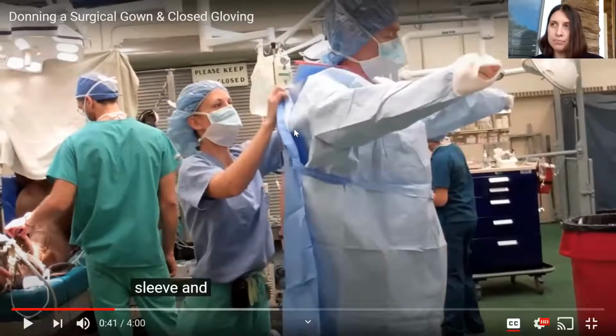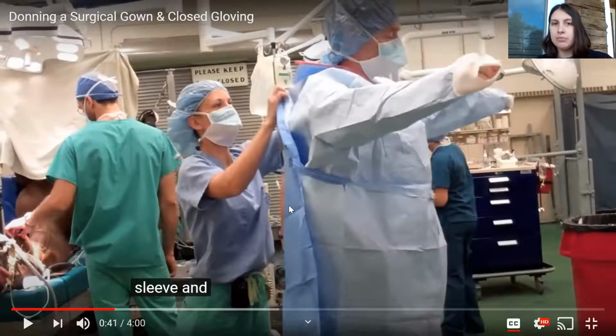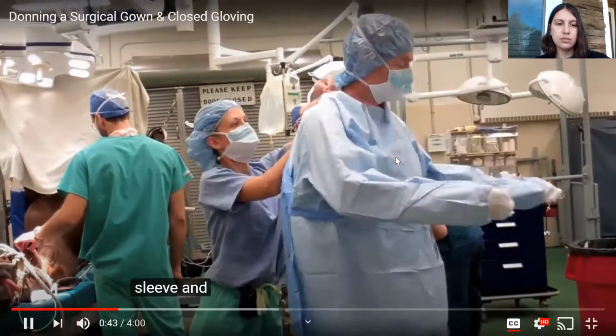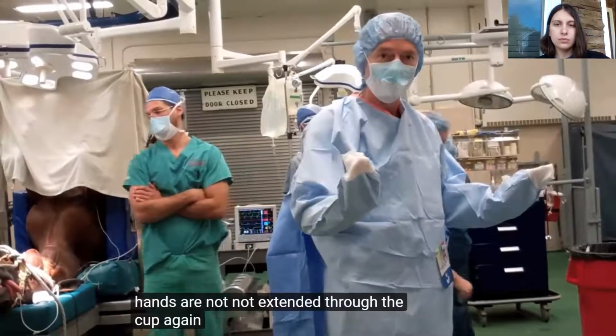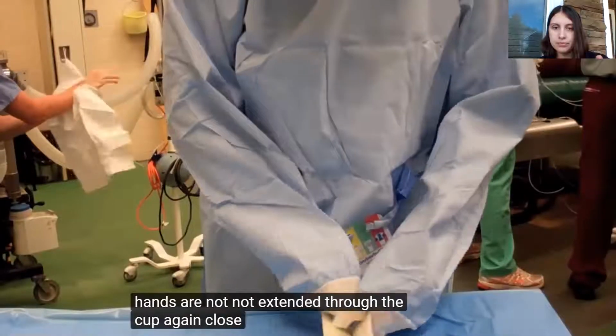So I'm going to pause real quick, just to make a note if you didn't see it. Notice the two different colors between the outside of the gown versus the inside of the gown. Where the assistant is grabbing it, she's touching the inside. She's not touching the outside, so she's maintaining that sterile field. This is a way better video.